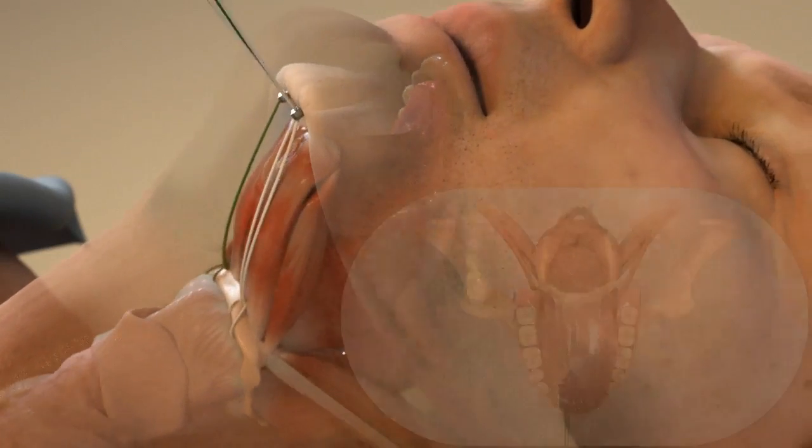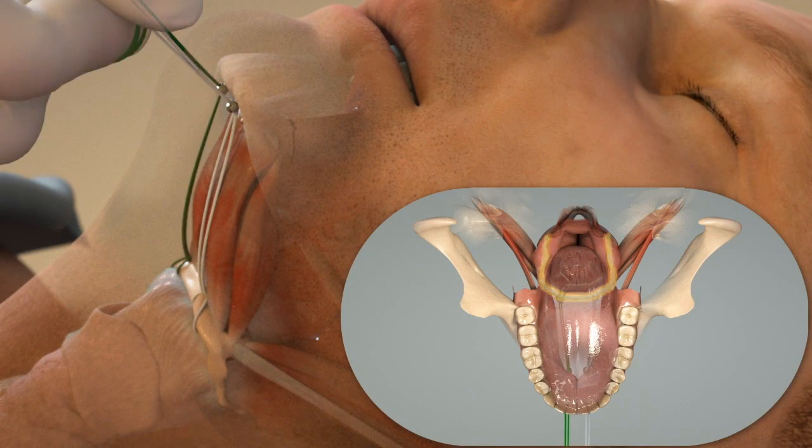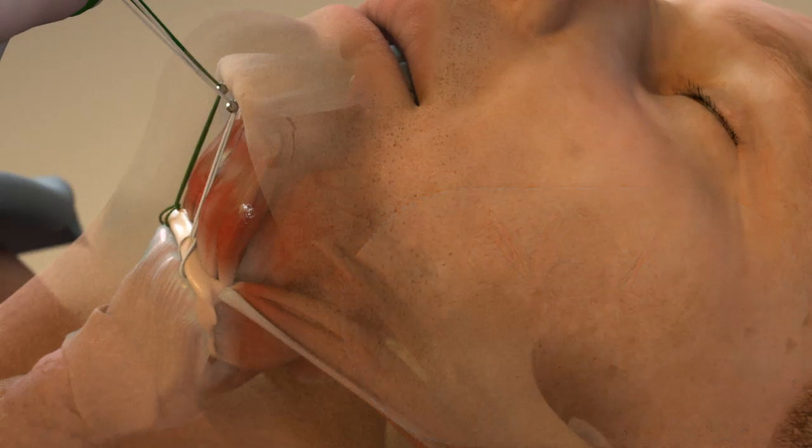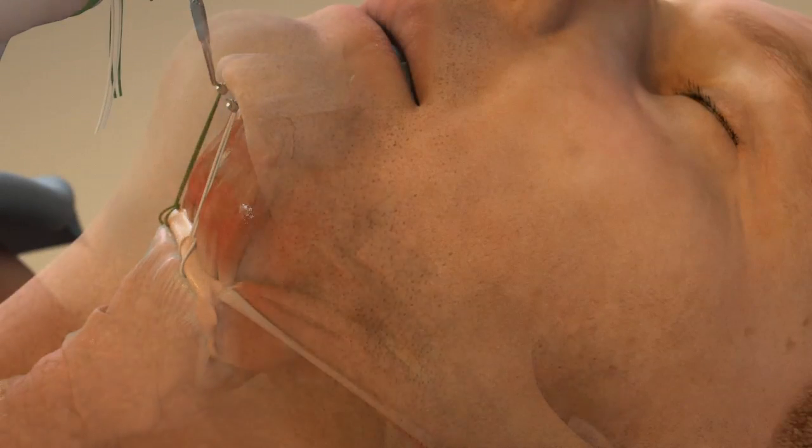With the head in a neutral position, the hyoid bone is lifted and suspended to the mandible by locking the sutures to the suture anchors. With encore suture anchors, the position of the hyoid bone can be easily controlled and adjusted at a later date. This is a feature not available in other systems. The incision is then closed.